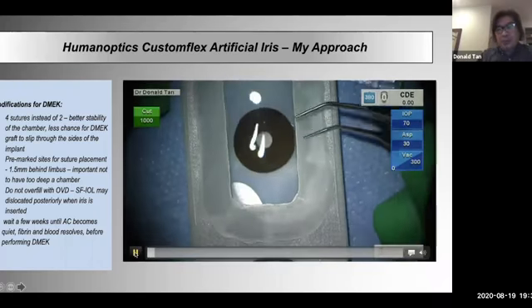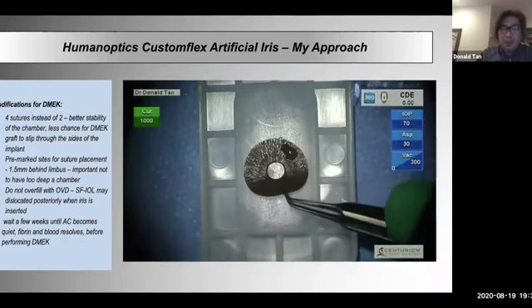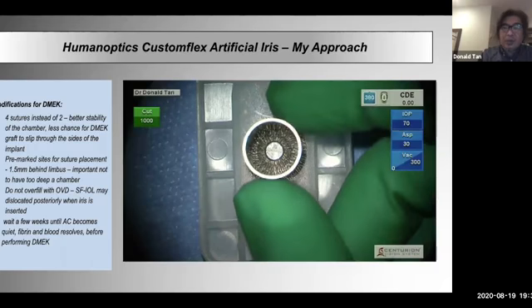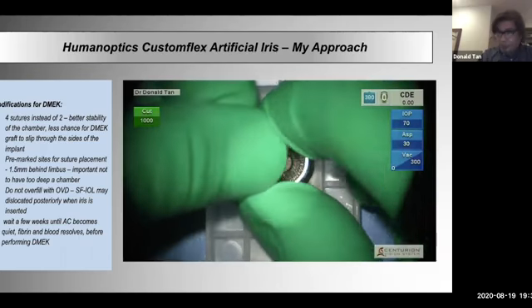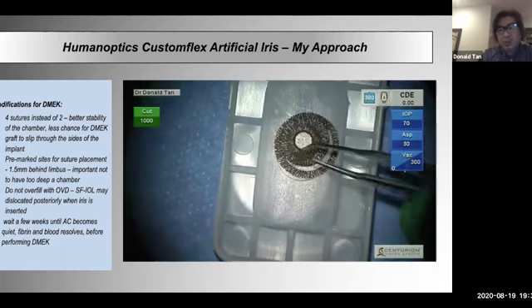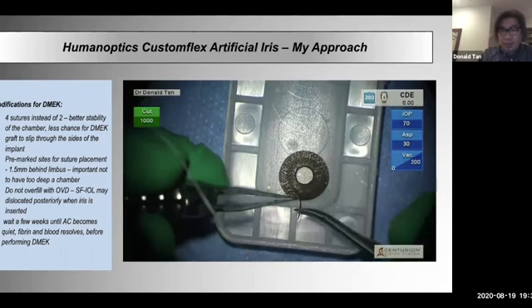So it comes in liquid there. Take it out. I just evert it. There's a nice stand on the opposite side, and you can trephine this with standard trephines. I just rotate it around to make sure I'm roughly centered. I look at it at all angles to make sure it's in the center. It's quite hard to trephine this, so you need to put quite a lot of force in. Even if you don't cut through, you can just trim it off, and that's it. So this is actually a 10 millimeter, and I'll show you this patient later.